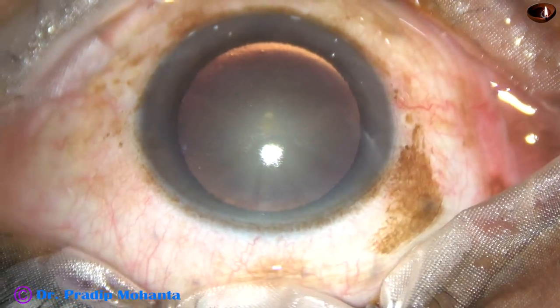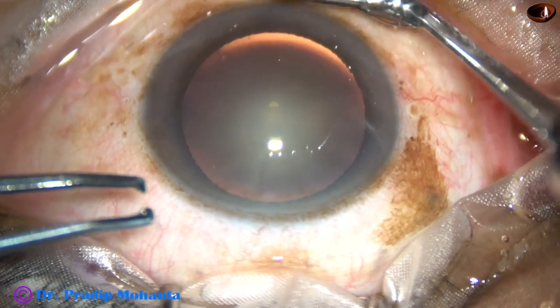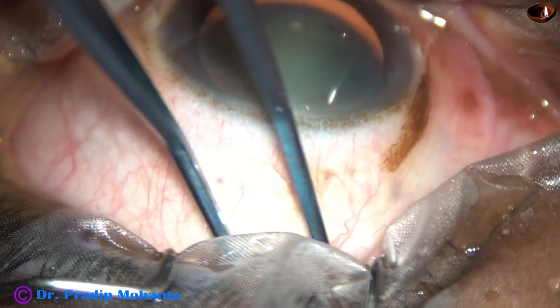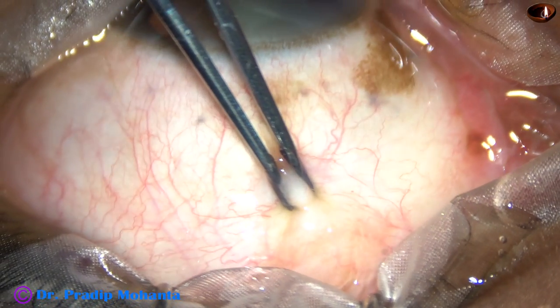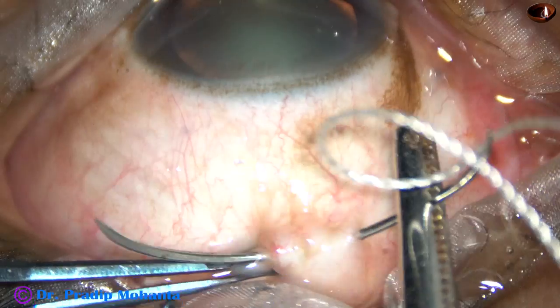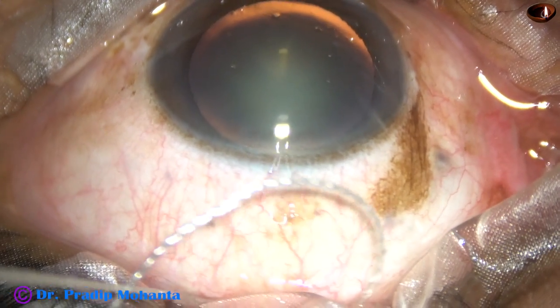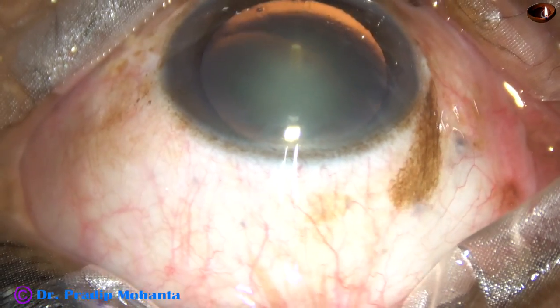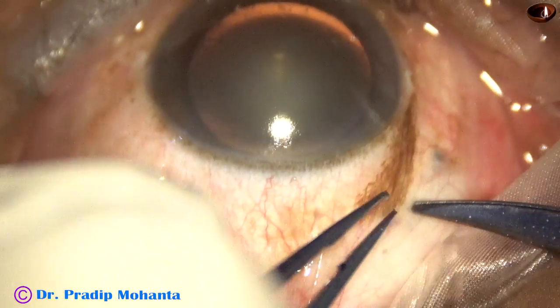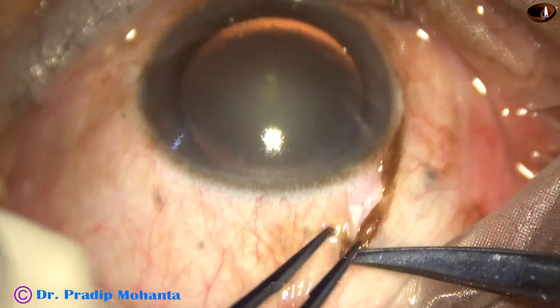This is a small incision cataract surgery. Superior rectus bridal suture is placed. First, the eyeball is pushed downward by a muscle hook. The superior rectus tendon is held, and then a thick nylon suture is passed beneath the superior rectus tendon. This suture is very much essential for making the eyeball stable. It acts as a third hand and is very helpful to new surgeons.